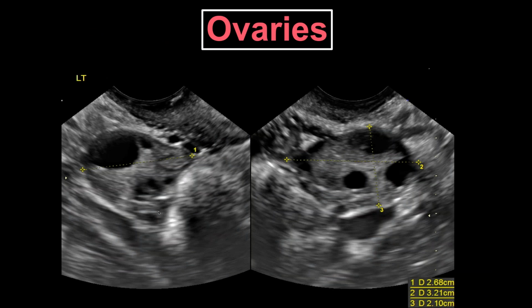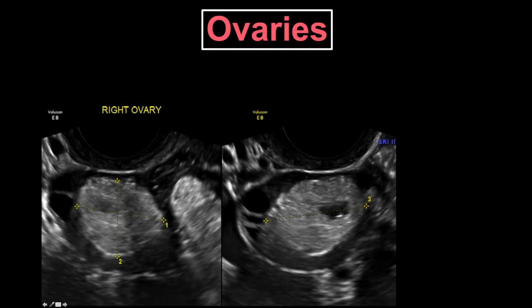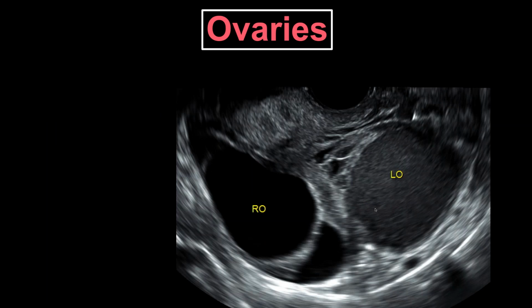Then I move on and look at the ovaries. Here we have a normal appearing left ovary. This is just 90-degree views of the ovary, sagittal and transverse. We can see some nice follicles. This is the patient's right ovary, and we notice this hyperechoic structure. This is a typical appearance for a dermoid. I'm only showing you a few examples of findings that we may have, because it would be a whole other lecture for me to show you all the possible findings in the myometrium, endometrium, and adnexa.